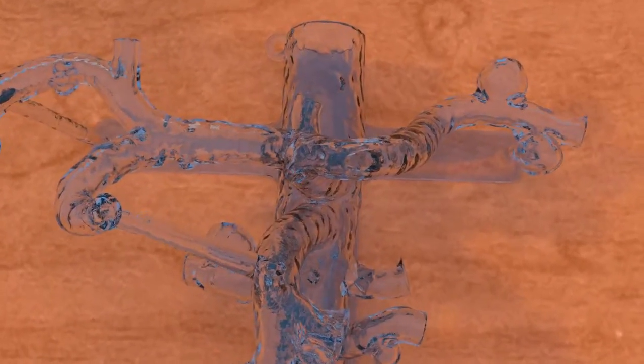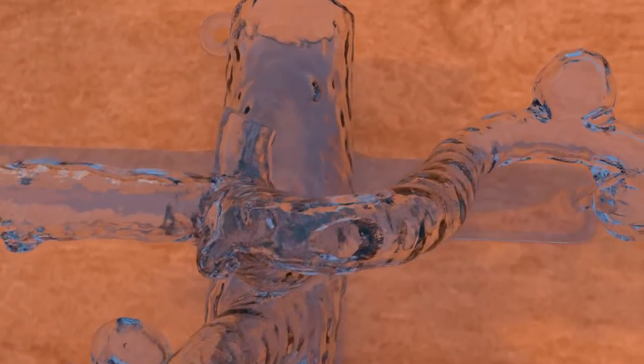A small splenic artery aneurysm version of the model is available as well, with an 11mm proximal aneurysm that has a 7mm neck, and a 10mm distal aneurysm with a 4mm neck.